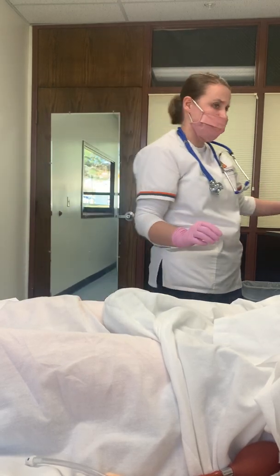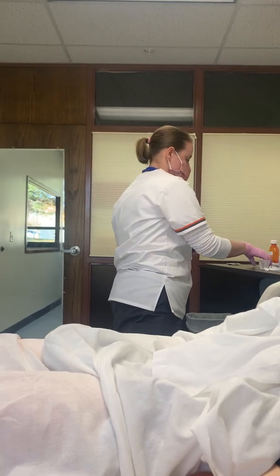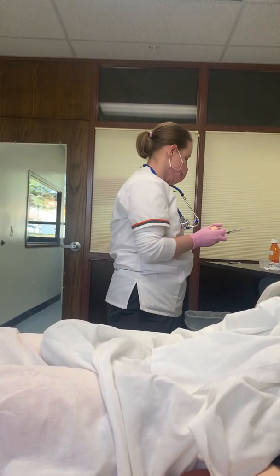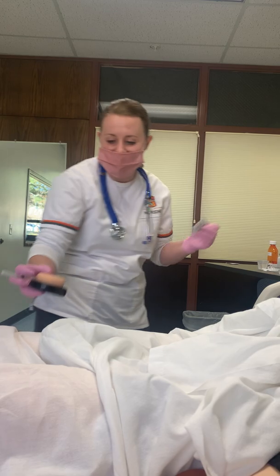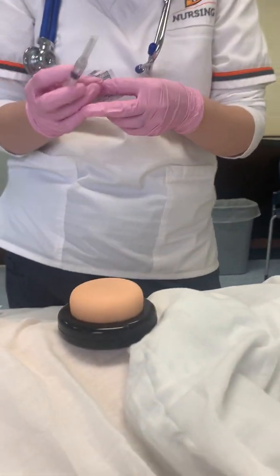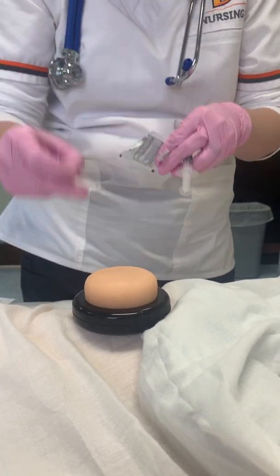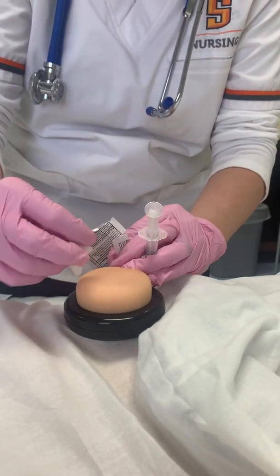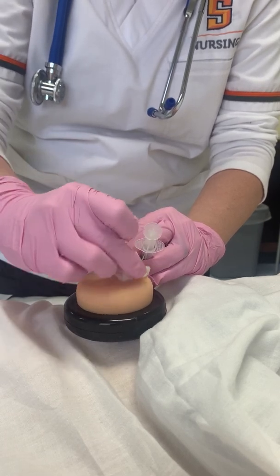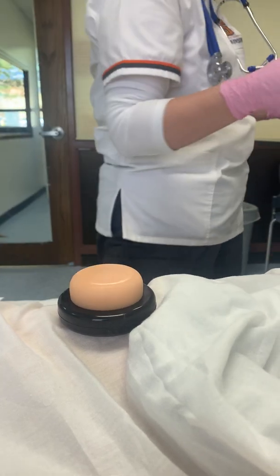And then I do this. I give it to her, right? Do you want me to just turn right here so you can see it? So I'm going to clean the site of injection around.